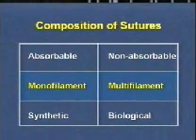Monofilament sutures are made of a single strand of material. Because of their simplified structure, they encounter less resistance as they pass through tissue than multifilament suture material. They also resist harboring organisms which may cause suture line infection. These characteristics make monofilament sutures particularly well suited to vascular surgery. However, because of their construction, extreme care must be taken when handling or tying these sutures. Crushing or crimping can nick or create a weak spot in the strand. This could result in suture breakage.